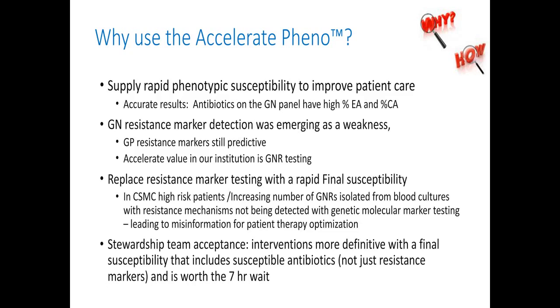Collaboration could be very important. Stewardship committee members, pharmacists, infection control, and ID physicians. It's going to be a collaborative effort, and they can help me provide necessary data to administrative leaders. And I think the most important thing is, for years we've been talking about things, but I think we're to a point now where we really have to provide data. It's not just words on how this equipment can really help us with either antibiotic optimization, patient days in the hospital, or help save lives or lower C. diff rates. We really need to provide data to prove that this could be true.